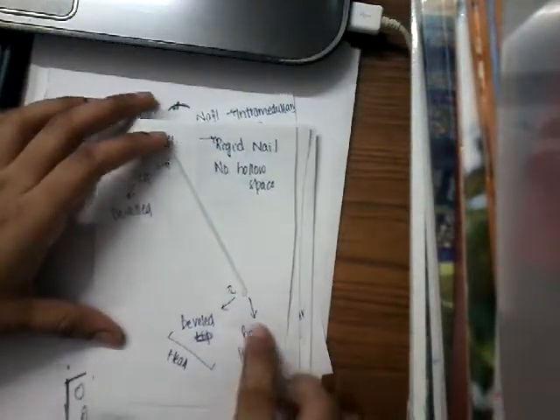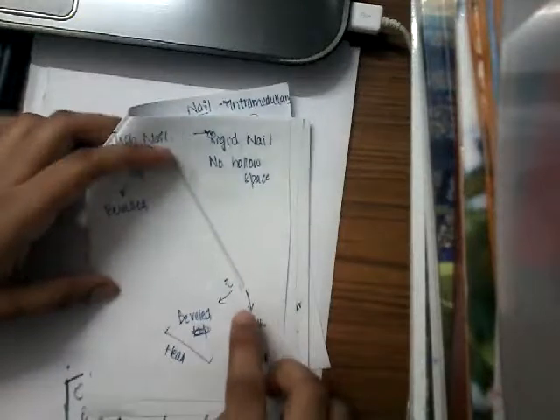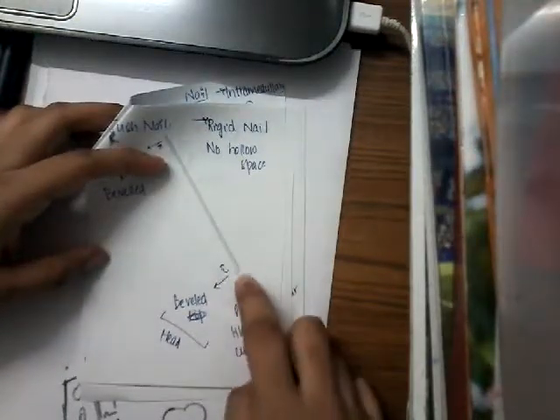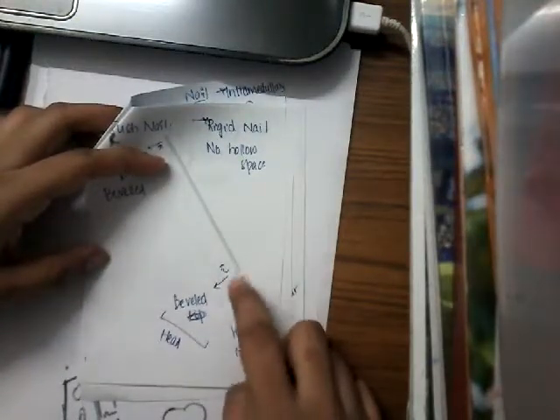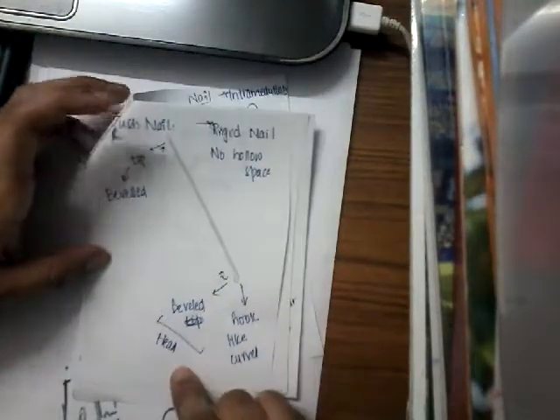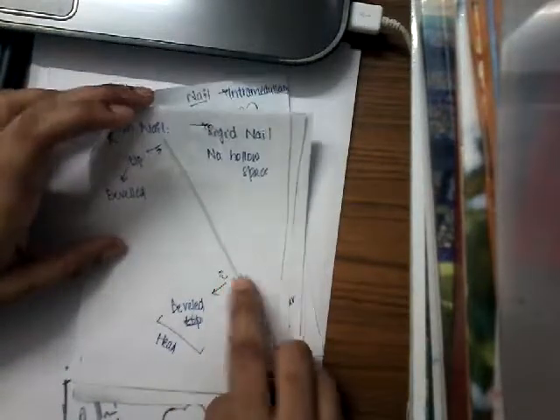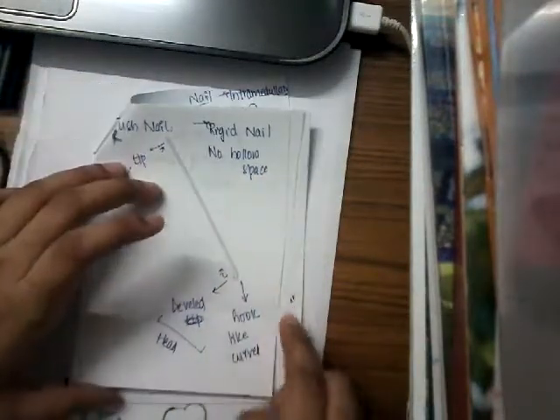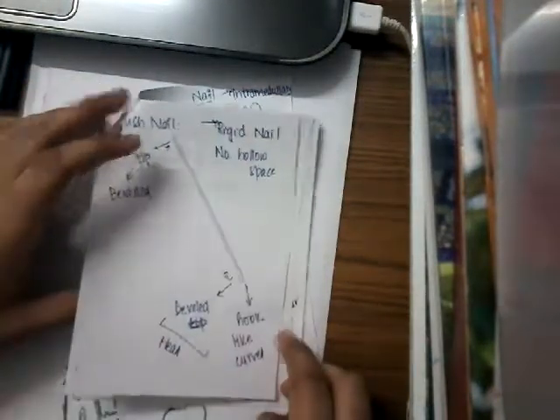This tip is beveled. Even the second tip is beveled and it has a hook-like curve. This is Rush nail having a hook-like curve. It is a rigid nail with no hollow space.